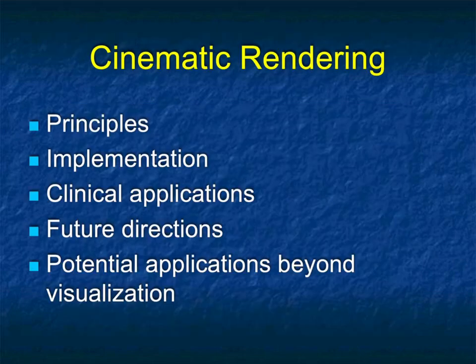Now, with cinematic rendering, let's look at some of the basic things. And I'm just going to start off, and then we'll come back with part 2 a little bit after.